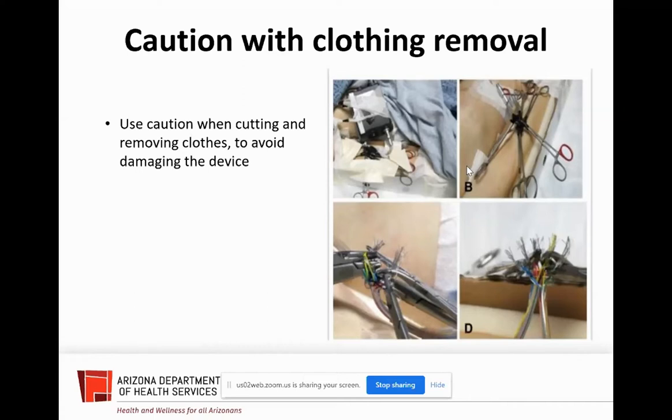We're going to talk about how the patient's doing, because when the LVAD stops, does anybody have a guess as to what goes on with the heart if the LVAD stops? What's the heart doing? Well, I would think it was only running on the top part of the heart, not the bottom. Still beating, okay. Just not effectively. Right. So the heart's still going to be beating, all right? Those ventricles are still squeezing. That right side's completely unsupported on these LVAD patients. So all of their four chambers are still going to be squeezing. So if the device stops for whatever reason, their cardiac function goes back to what it was before, which is garbage, which is why they have an LVAD. So most likely they're going to be symptomatic, not feel well, look like a low output state, low perfusion, probably start to deoxygenate. So you're right. You're going to call the coordinator.